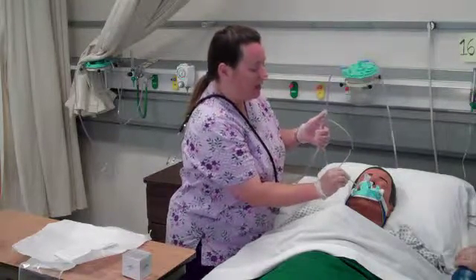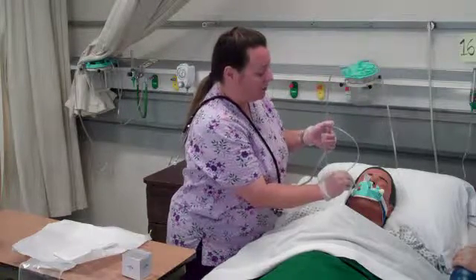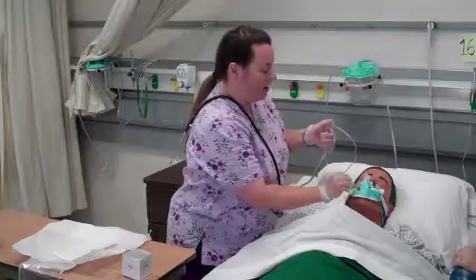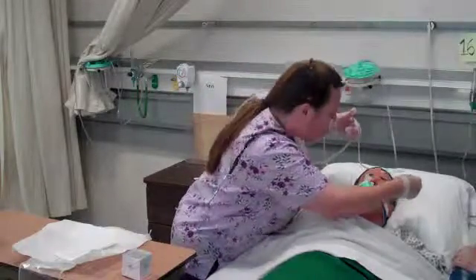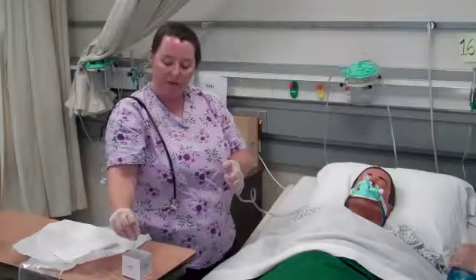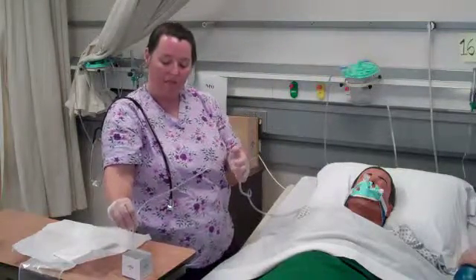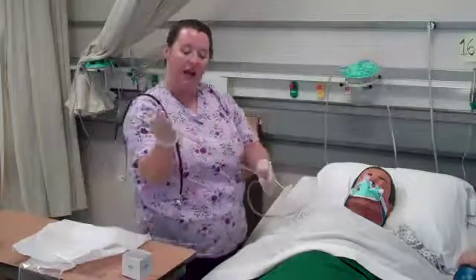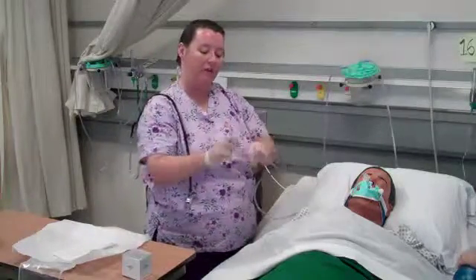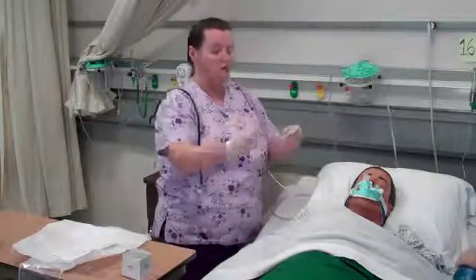Again, same thing. Now it's a clean procedure. This oral cavity is not a sterile cavity. Intermittent suction as I go around the oral mucosa here. Again, I'm going to clean my tubing before I end my procedure. I'm going to take and gather that catheter in my hand. I'm going to remove my vacuum source. You can go ahead and turn that off for me.